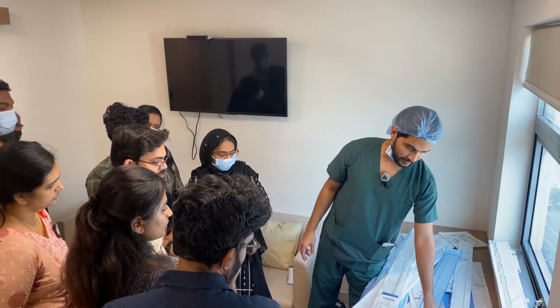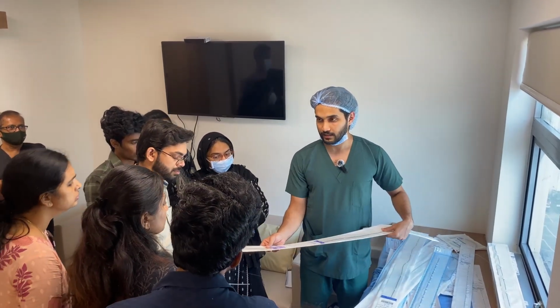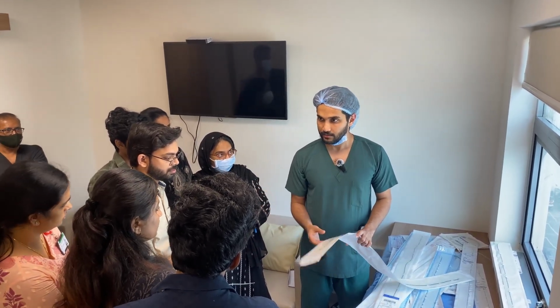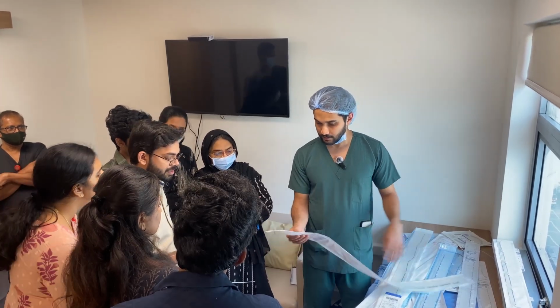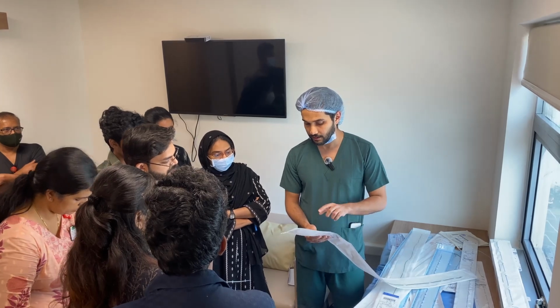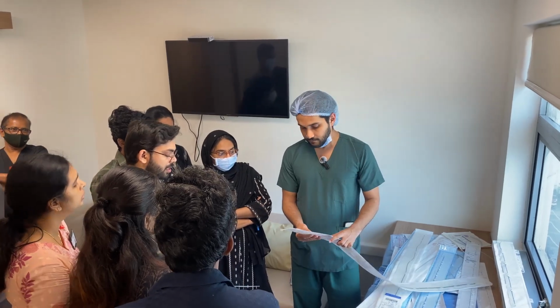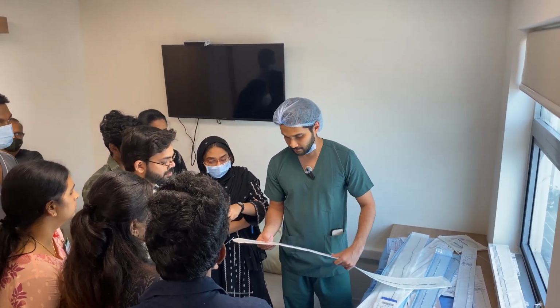ഇതിൽ സപ്പോർട്ട് ചെയ്യുന്ന വയർ 5 ഫ്രഞ്ച്, 100 സെന്റിമീറ്റർ, 0.035. ഇത് വേറെ ഡിഫറെന്റ് ടൈപ്പ് ഓഫ് കത്തീറ്റർ ആണ്. വെർട്ടിബ്രൽ ഗ്ലൈഡ് എന്ന് പറയും. വെർട്ടിബ്രലിൽ സേഫ് ആയിട്ട് ഹുക്ക് ചെയ്യാൻ ഉപയോഗിക്കുന്നത്. പക്ഷെ നമ്മുടെ സെറ്റിംഗ്സിൽ സെറിബ്രൽ ഗ്രാമിന് പൊതുവെ ബേൺസ്റ്റീൻ ആണ് ഉപയോഗിക്കുക. പക്ഷെ ചില സമയത്ത് ബേൺസ്റ്റീൻ ഉപയോഗിക്കാൻ പറ്റാത്തപ്പോൾ നമ്മൾ ഇത് ഉപയോഗിക്കും. ഇതിന്റെ ടിപ്പിൽ വ്യത്യാസമുണ്ട്. പിന്നെ ഈ ഗ്ലൈഡ് എന്ന് പറയുന്നത് ഇതിന്റെ മെറ്റീരിയലാണ്. ഇത് ഹൈഡ്രോഫിലിക് കോട്ടഡ് ആണ്. ഇതിന്റെ കളർ വെച്ച് മാത്രമേ തിരിച്ചറിയാൻ പറ്റൂ.